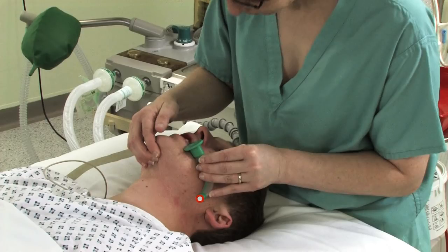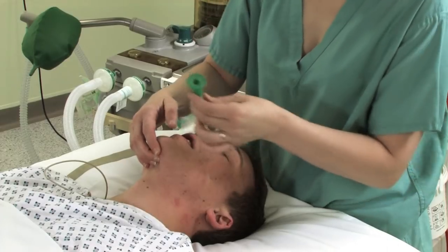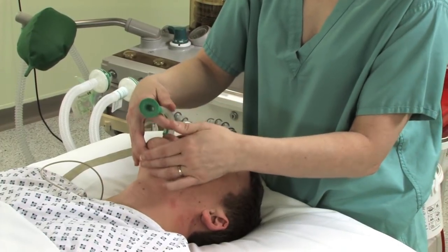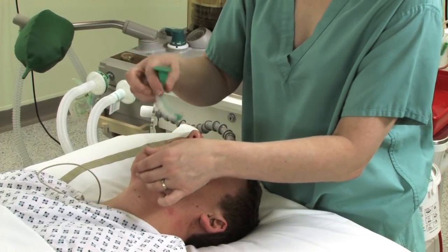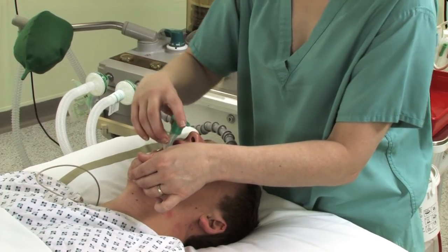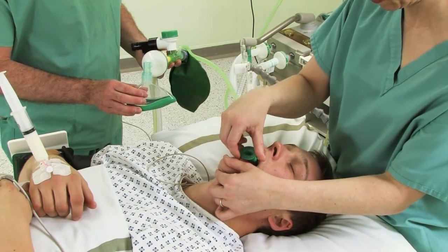In the adult patient, the airway should be inserted with the pharyngeal opening facing the roof of the mouth, then rotated 180 degrees as it passes the back of the tongue.